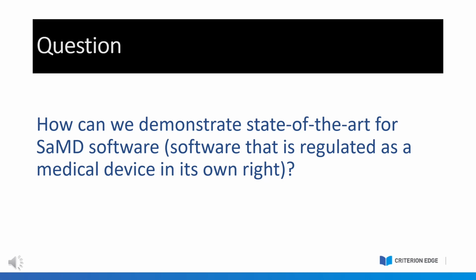How can we demonstrate state of the art for software as a medical device software? So let's keep in mind that there's a difference between SAMD and SIMD. I'm sure you know which your software is, but just as a refresher for the rest of us, software as a medical device is software that is a medical device and can perform those functions on its own.